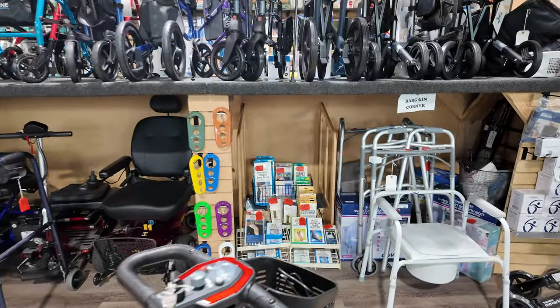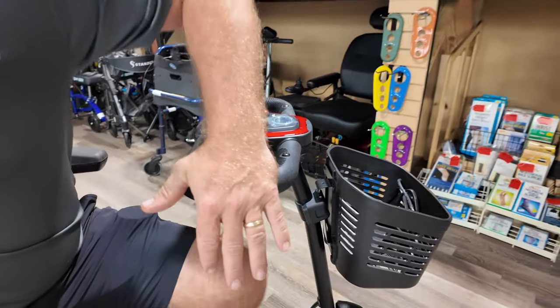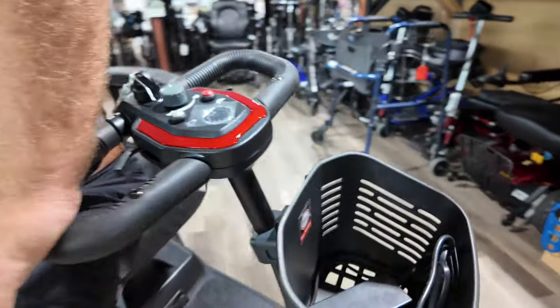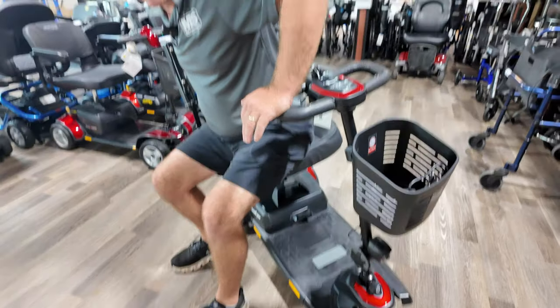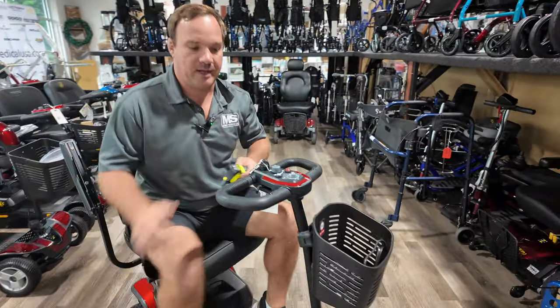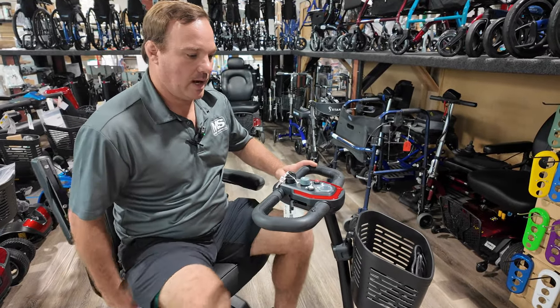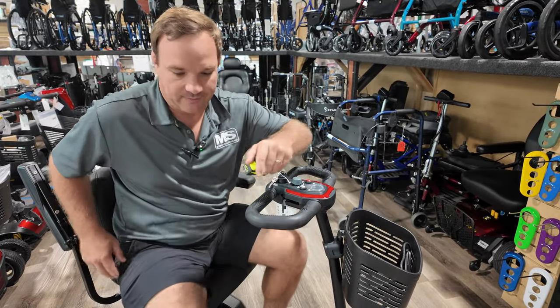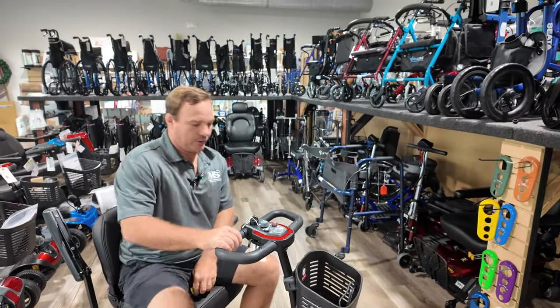Be careful with a scooter if you have balance issues — if you get out of it putting all your weight on the side, this could be a problem. If you're buying this for someone with memory issues who can't remember to swivel the seat, or can't get out without pushing on it, I would stay away from a three-wheel scooter.